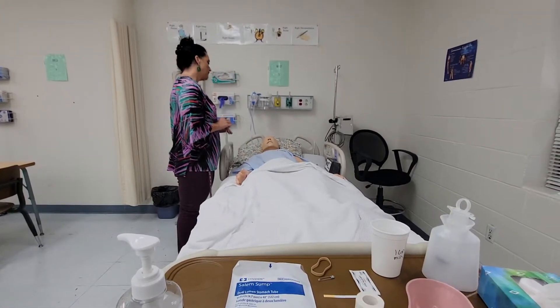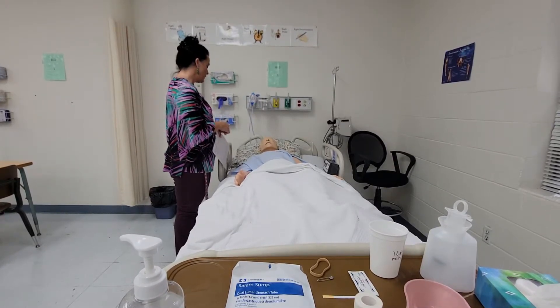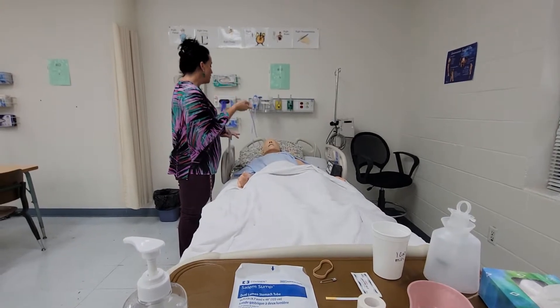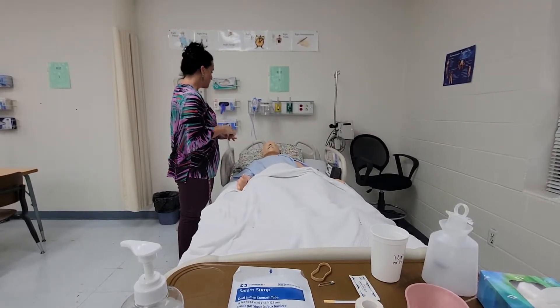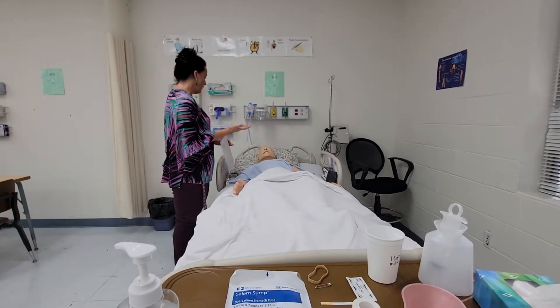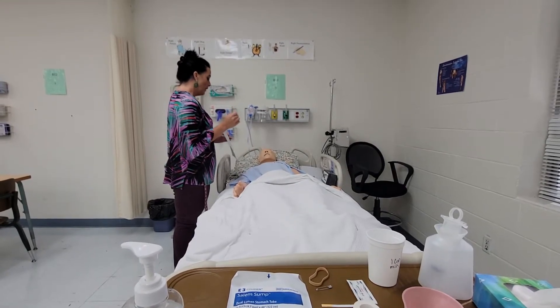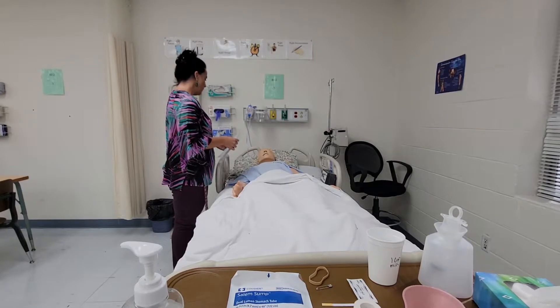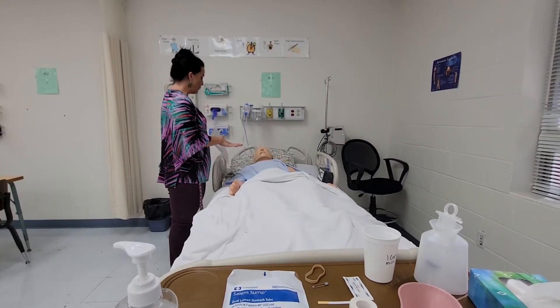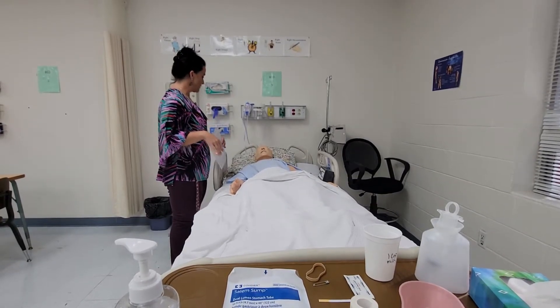The doctor has ordered an NG tube to be placed. Are you familiar with an NG tube? If they say no — it's a small tube that will go into your nose, down your throat, and into your stomach. We'll hook it up to suction and it'll suction out the stomach contents, which will really relieve whatever they have going on. If you have any questions, let me know. I'm going to set up my supplies and get ready.